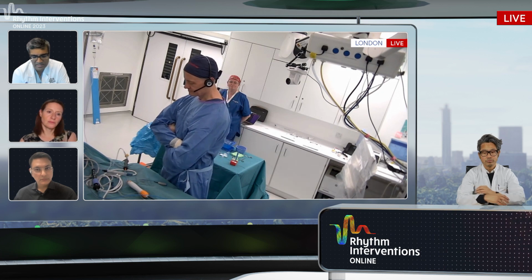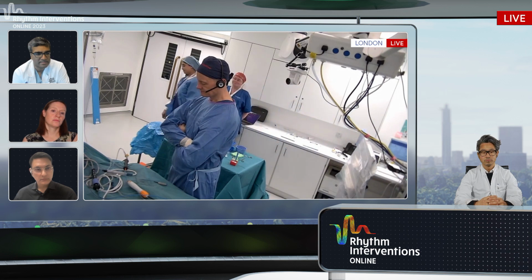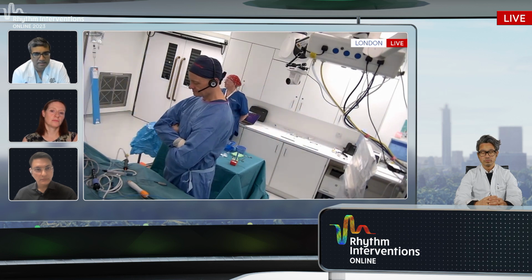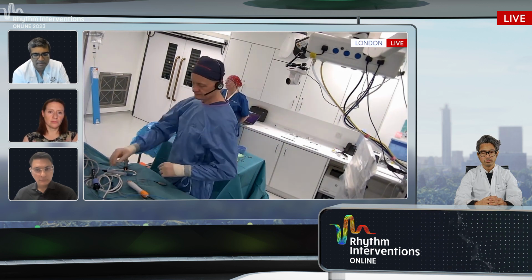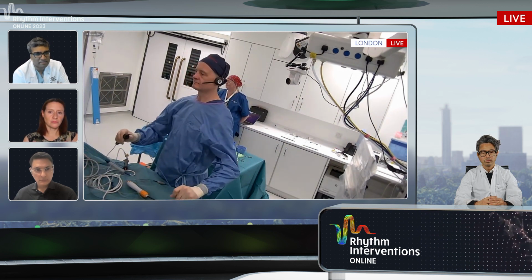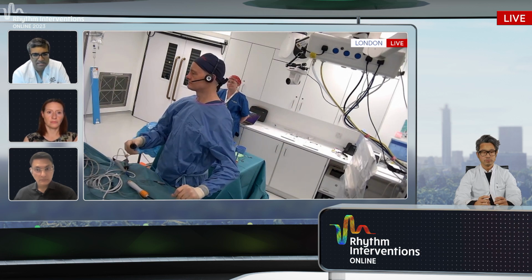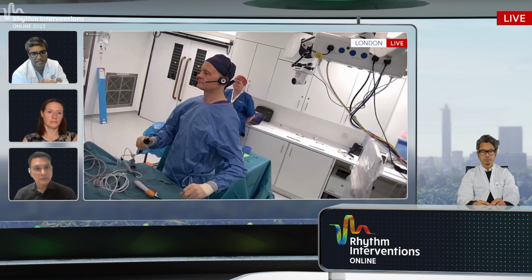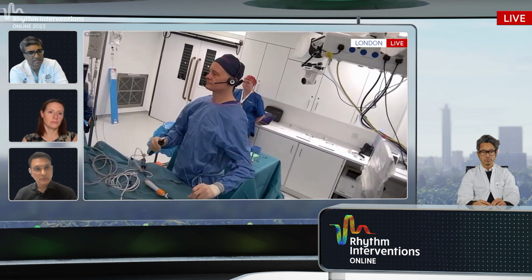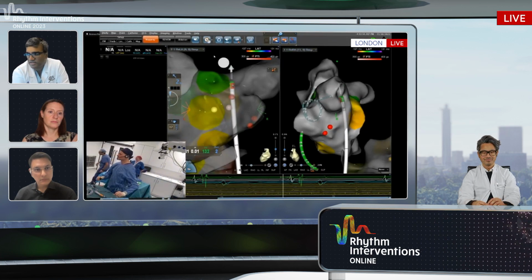So in terms of how we do it, we like to give 20 mics per minute of isoproterenol. That's the typical dose. It's pretty high dose, which is what you want. Oftentimes you won't see anything happen. You've got to wait 10 minutes or so, maybe 15 minutes. Oftentimes we'll fibrillate purposefully with rapid pacing on isoproterenol and then shock, because sometimes then you start seeing triggers. And if nothing is there, then you're done.